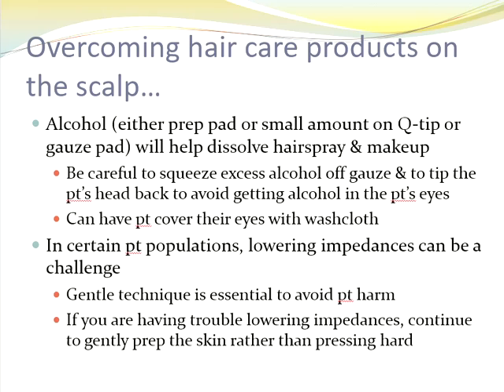I would even recommend just grabbing a washcloth and having the patient cover their eyes with it to make sure that it does not get in their eyes. The other thing with rubbing alcohol is be mindful if you're using it on somebody that just shaved, sunburn, all of that.